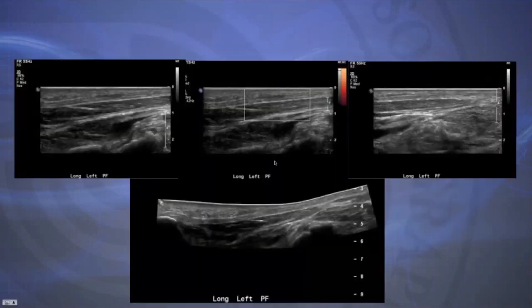These are all consecutive images. We've already taken all of our proximal images, so these are moving more mid into the distal aspect. We do throw power Doppler on, and then we do a nice panoramic image to show the entire plantar fascia.